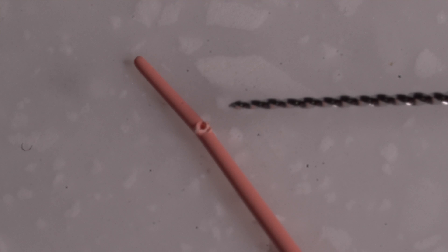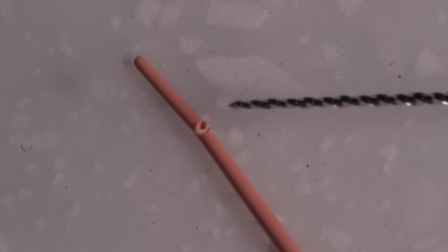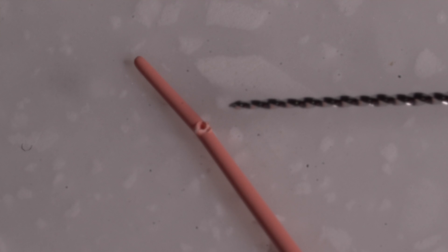First shape your mesio-lingual and place a GP point all the way to the apex, then take out the GP point and if you see a small dot on there, you know the mesio-buccal has joined the mesio-lingual — and there's your GP point confirmation.